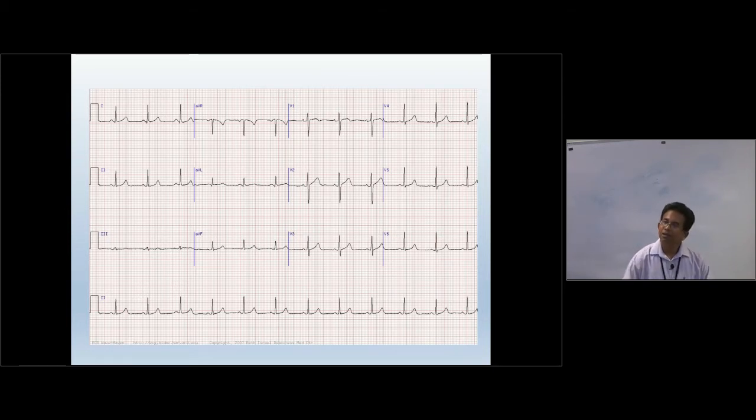Okay. Now to understand how various electrodes generate various patterns of ECG waveform, we need to understand how we position electrodes around the heart. Okay. If you carefully analyze, you will notice we arrange these electrodes in 2 different planes, in a vertical plane and in a horizontal plane. Okay, so I'll draw a picture on the board, so it's much easier for you to understand.